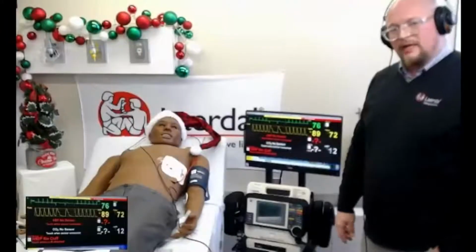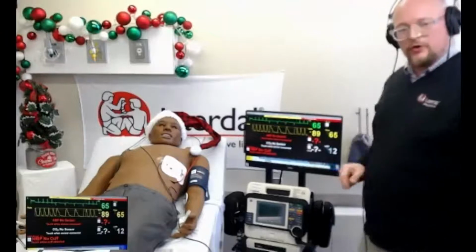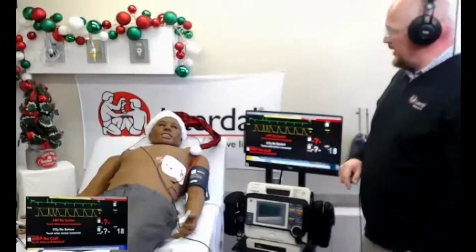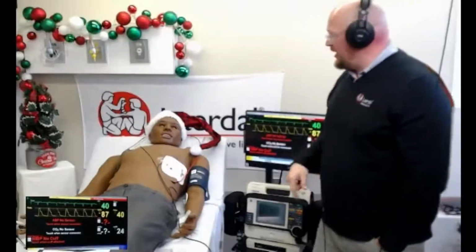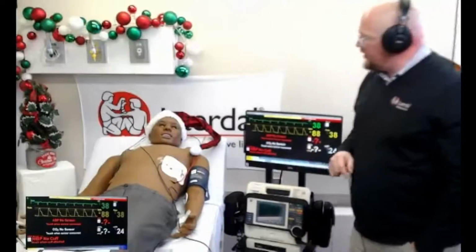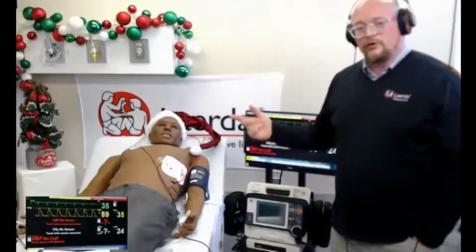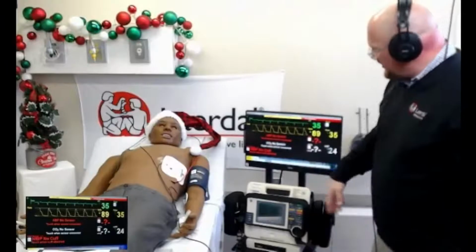Perfect. All right, so now I have a third degree. We have a Brady, and we also have a lot of sweating here now. We're seeing an AV nodal third degree block, and the blood pressure and everything.